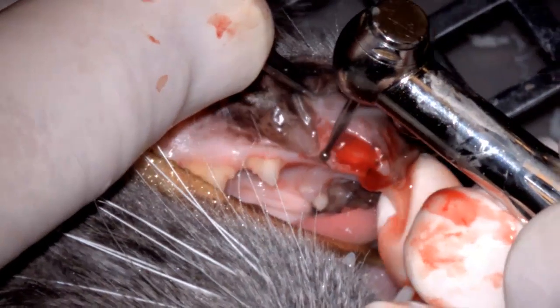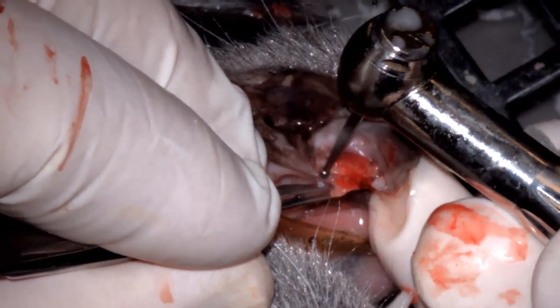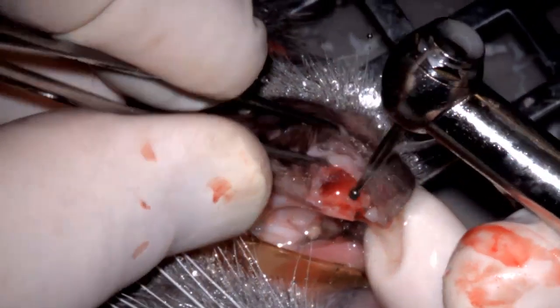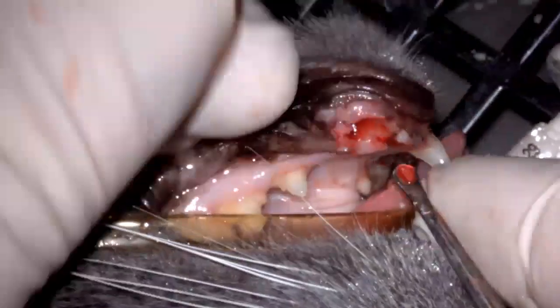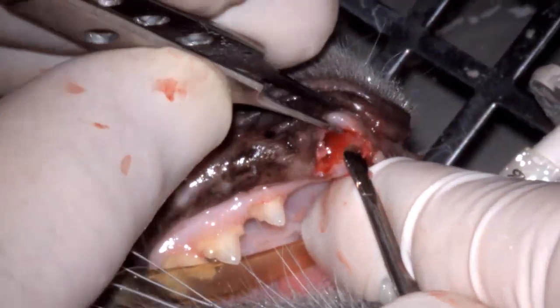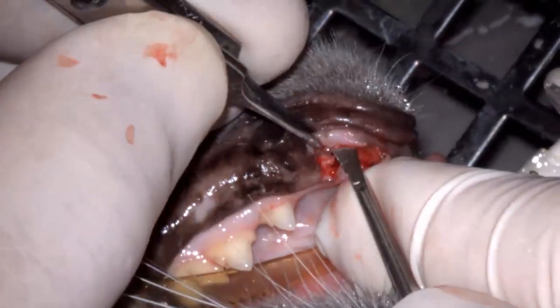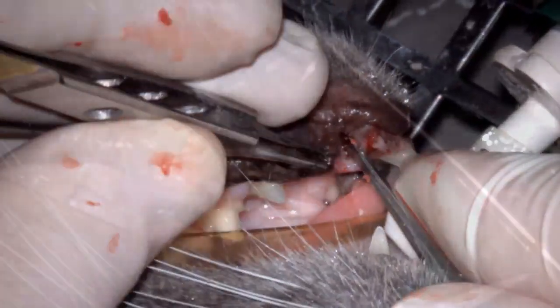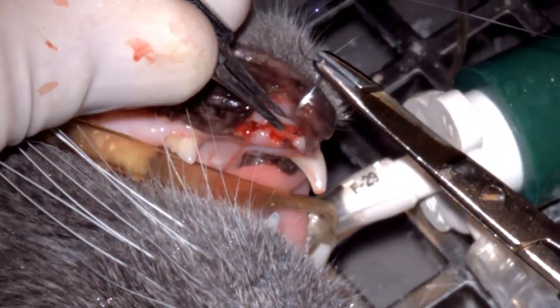Now I'm going to smooth down the top of the socket to take off any sharp edges — this is known as alveoloplasty. I smooth down the top edges of the alveolar crest so the flap lies on a smoother, flatter layer of bone. After that, we'll curette out any bone dust or little bits of debris, undermine the flap a little more. Here I'm using the periosteal elevator turned around with the curve out towards the soft tissue to incise the periosteum on the inside of the flap and give myself more mobility. And now we're going to start suturing the wound.